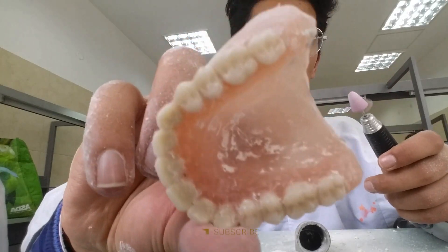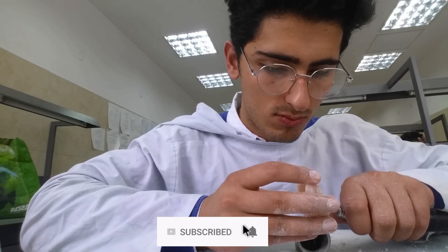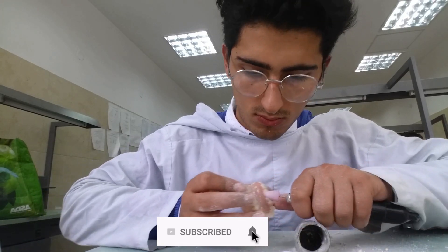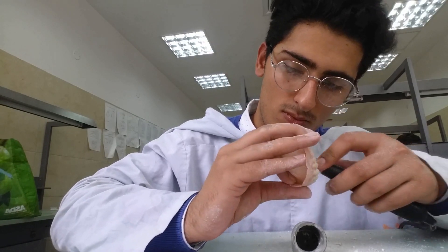Once we have removed our denture from the flask, we are nearly done — we pretty much already have our denture in hand. The only steps left are to clean it, remove the gypsum, and polish it. We start the polishing phase using burrs: we use burrs to take off the bigger parts of gypsum, gradually moving to softer and softer burrs, with the final burrs containing sandpaper — the softest we have.